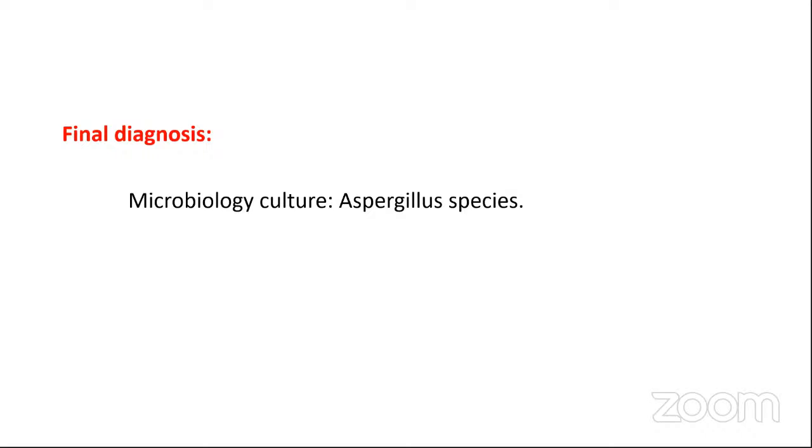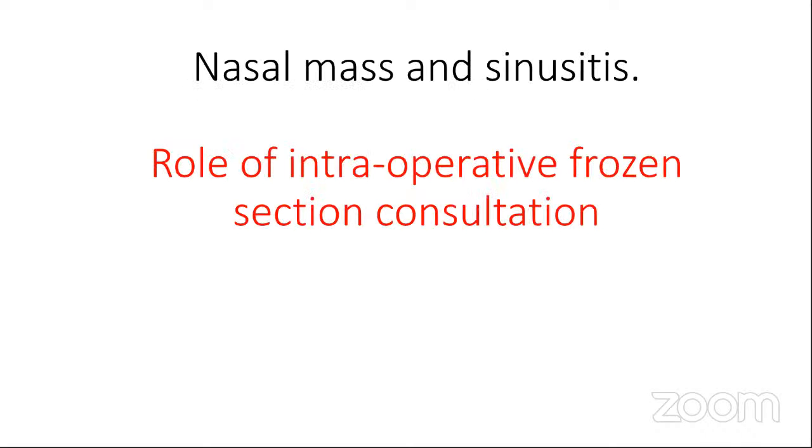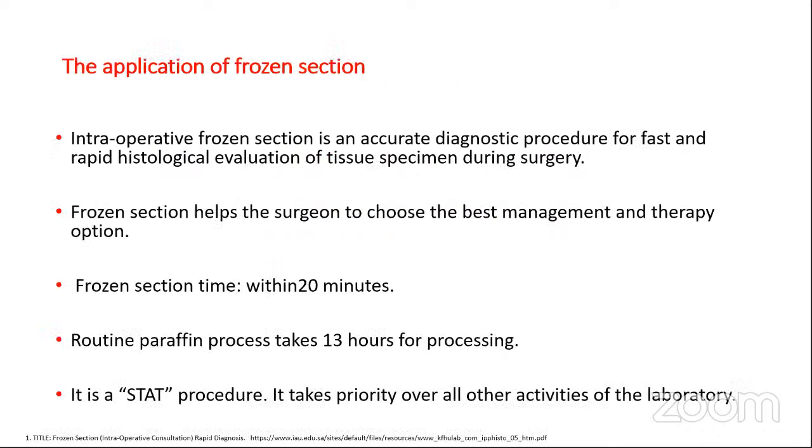I want to emphasize that for histology diagnosis of fungus, we can suggest the species, but the gold standard for diagnosis is microbiology culture. So after I presented to you a case of sinusitis and nasal mass, I want to take this opportunity to talk about intraoperative frozen section consultation.